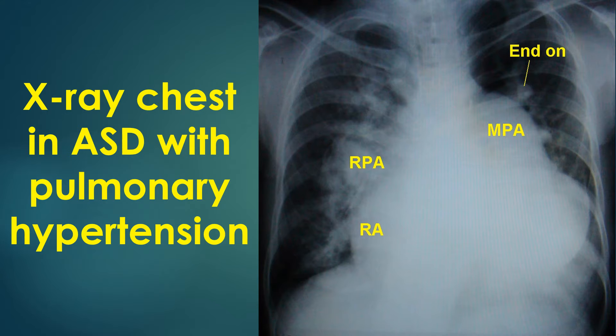The apex is upwards, suggesting a right ventricular configuration. All features suggest large secundum atrial septal defect with a large left-to-right shunt producing severe pulmonary hypertension.